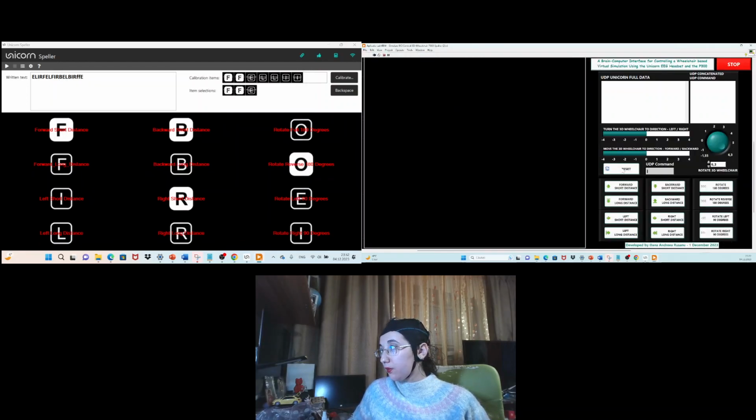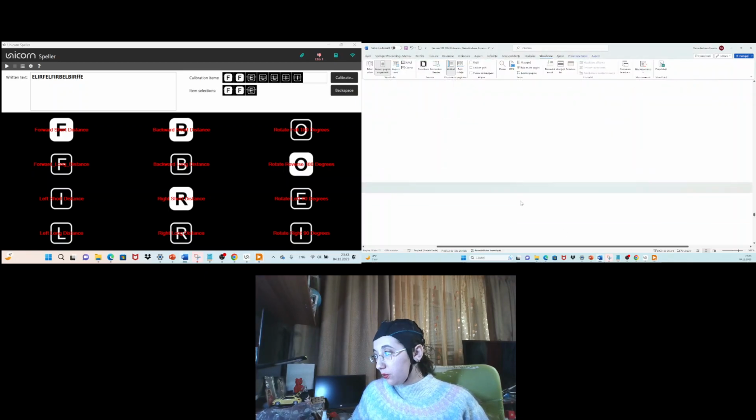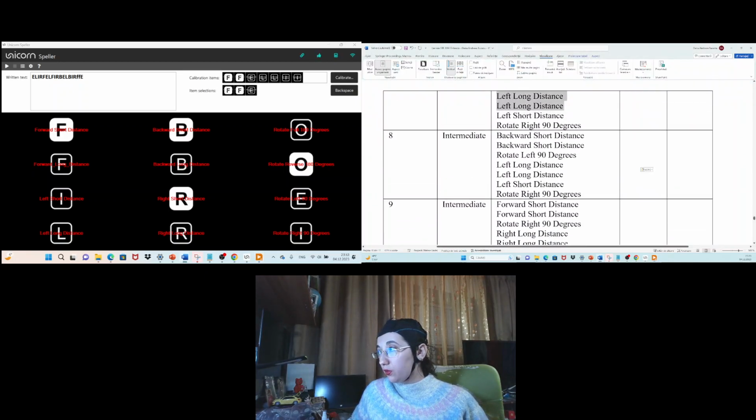Okay, so until now I sent forward short distance 2 times, this one, and then rotate left with 90 degrees, this one. Okay. And now I will continue with 2 times left long and then 2 times left short, I believe. So yes, left long, 2 times left short, and rotate right. Okay.